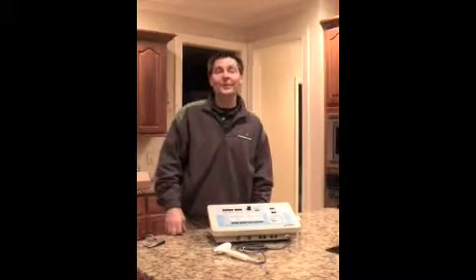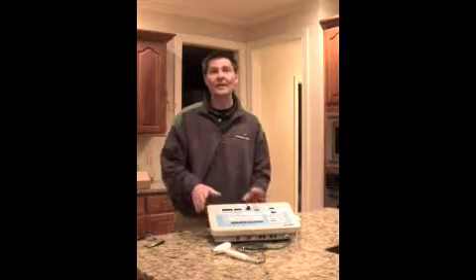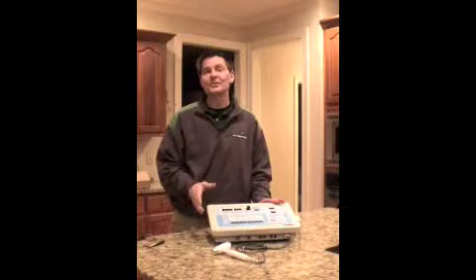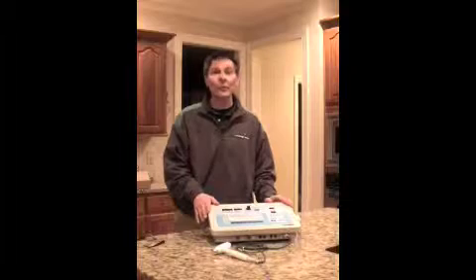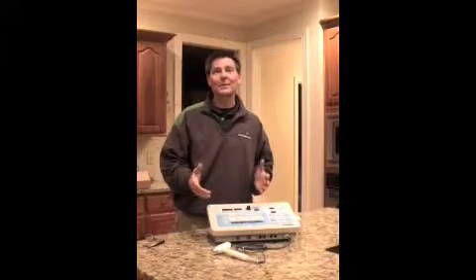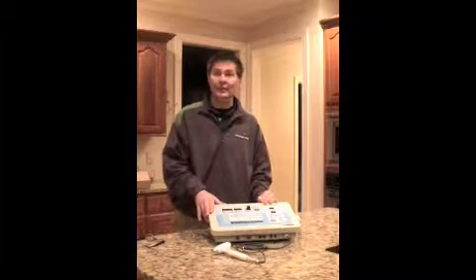Hello and welcome to this video in-service on the Richmar CM2, which is a combination ultrasound and stim unit. My name is Jeff Worrell and I represent Advantage Medical — we are the distributors for the Richmar equipment. Since we may not be able to be at your facility in person, I hope that you'll find this video in-service helpful.